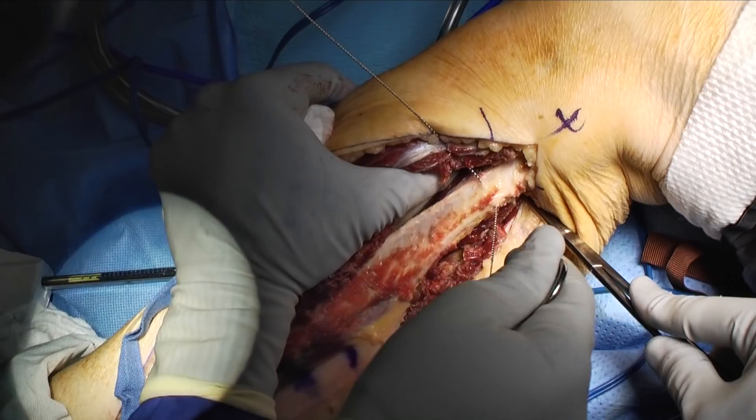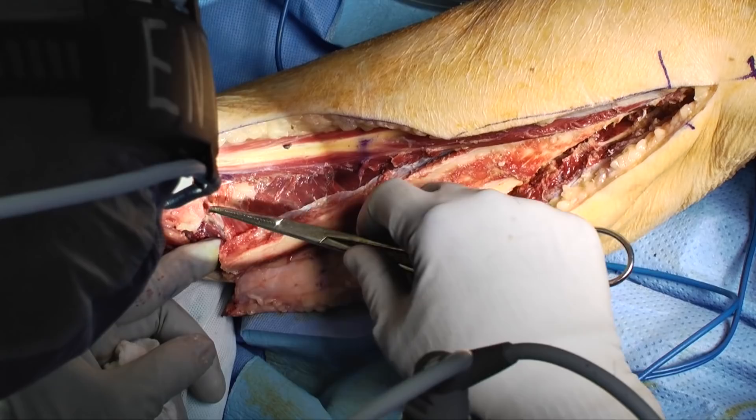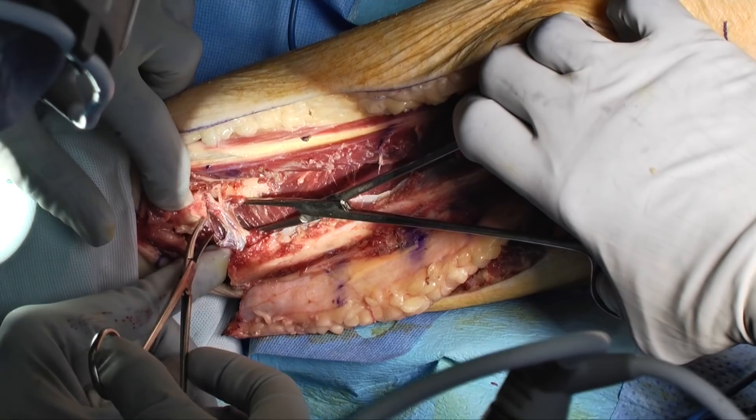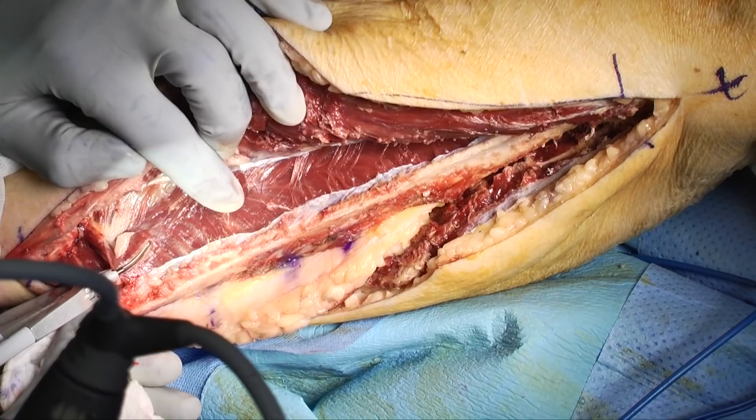This is a relatively atraumatic cut in the bone. Cuts are made proximally and distally, and at the time the distal cut is made, the fibula can be elevated slightly laterally to identify the distal peroneal artery and venae comitantes. If these vessels are not seen, they are just deep to the posterior tibialis and a small amount of muscle needs to be cut. Once these vessels are identified, they're clamped and tied distally. The peroneal vessels maintain their width throughout the entire length of the fibula.